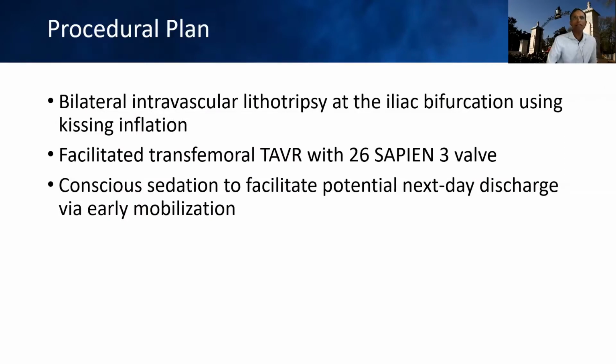So our procedural plan in this case was to try to maintain the benefits of transfemoral TAVR, but to facilitate this with intravascular lithotripsy, and to actually perform this with kissing balloon inflation and bilateral lithotripsy at the bifurcation to change the compliance of both lesions and to reduce the chance of obstruction of the contralateral iliac artery. In these cases, we typically do these with conscious sedation to really maximize the benefit of the transfemoral workflow so that we can mobilize these patients and realize those benefits of ideally potential next day discharge.